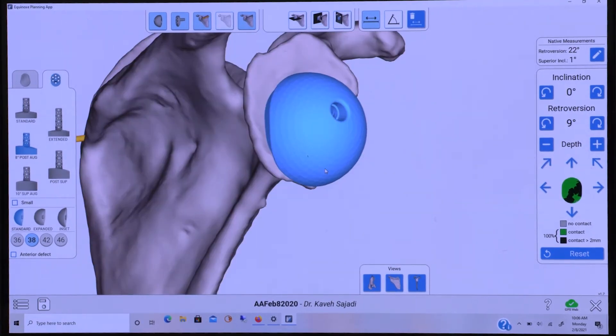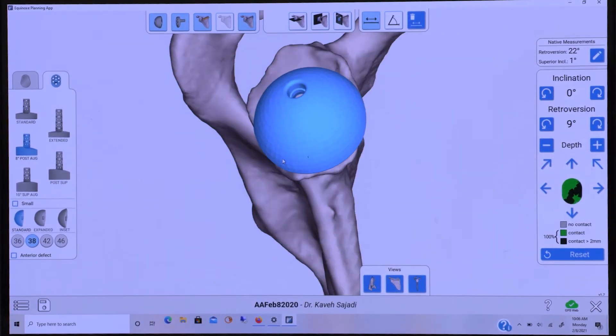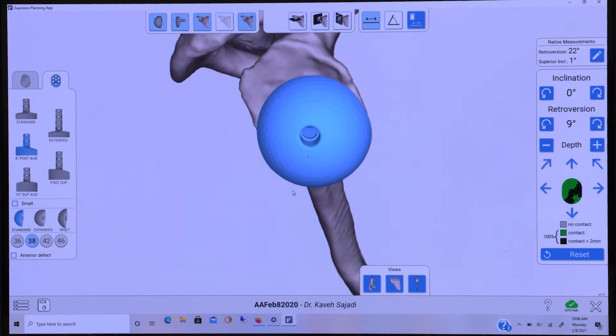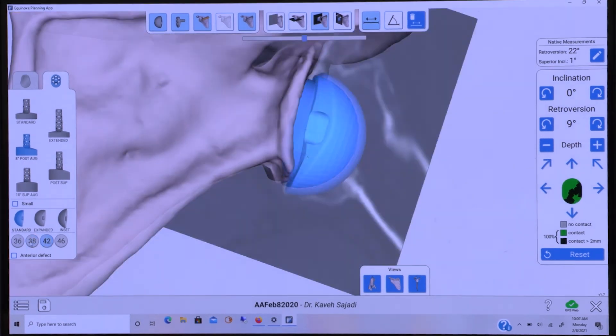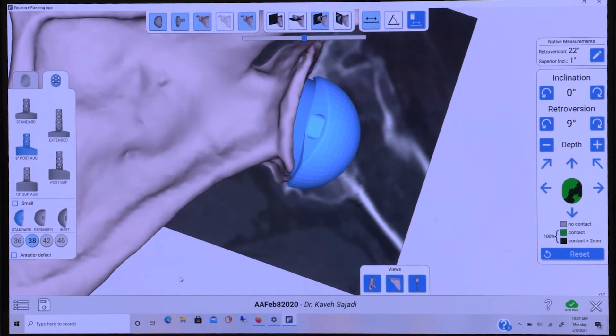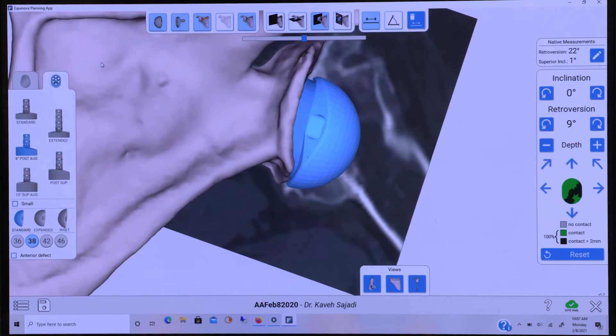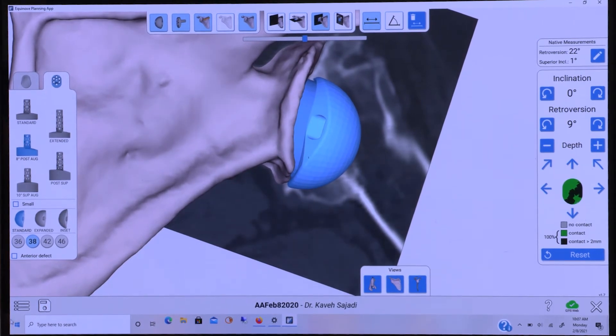The planning software also allows us to choose the appropriate size glenosphere for the patient, trialing both the 42 and the 38 glenospheres, ultimately selecting the 38.